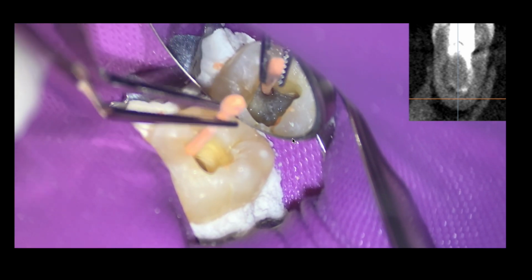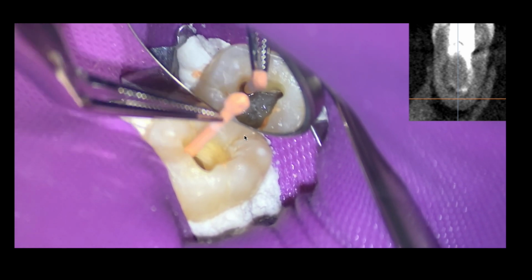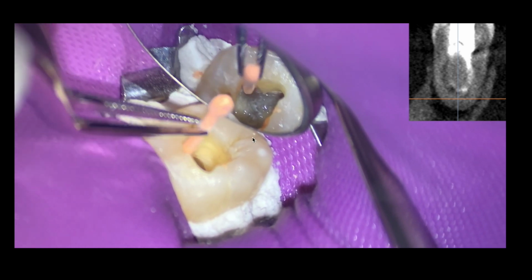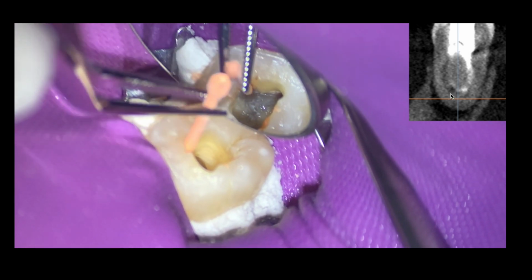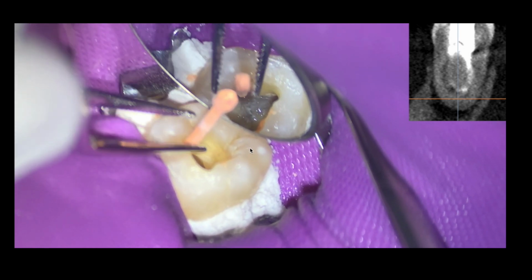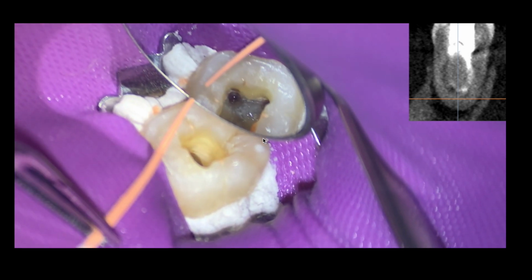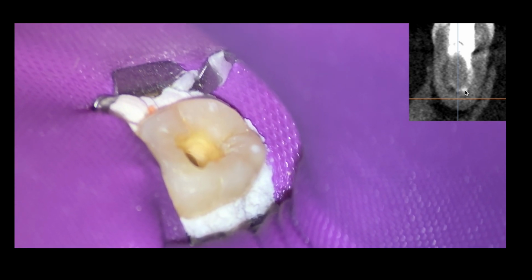So what I'm going to do here is, you saw me activate with the activator. Now I'm going to go old school with this manual dynamic activation. Just any way I can irrigate all this little area out, try to bounce all that stuff out of there. I actually took that 40 file, I bent almost a 90-degree little bend at the apical third, to try to scrape anything out of there. I don't know if I left it in here. It was kind of boring.